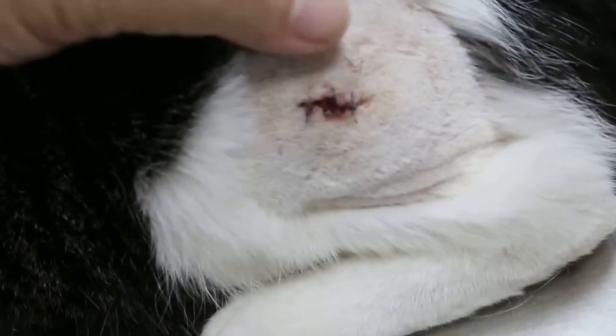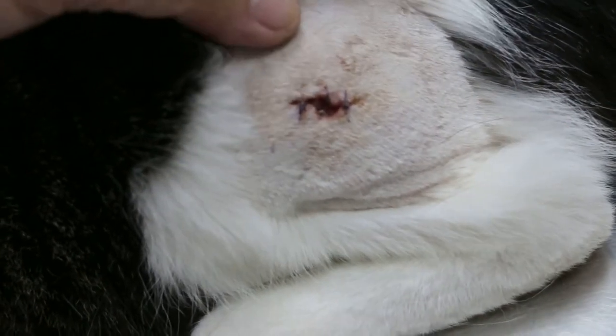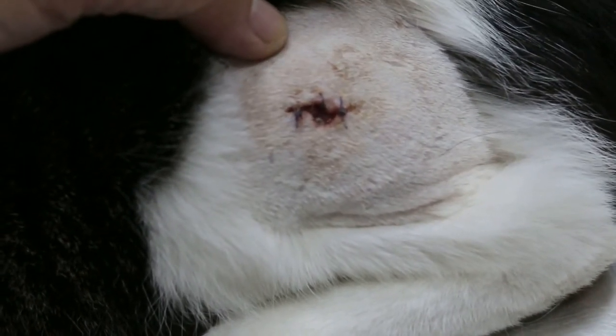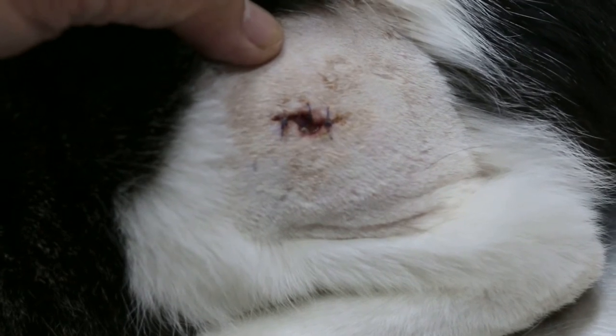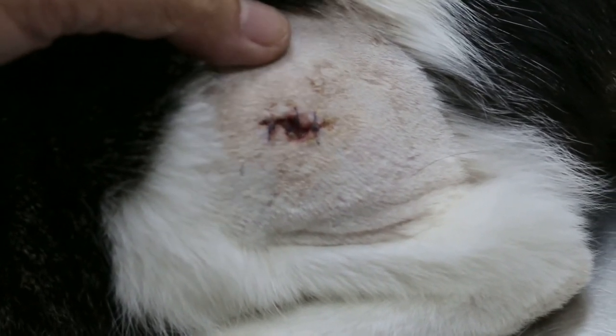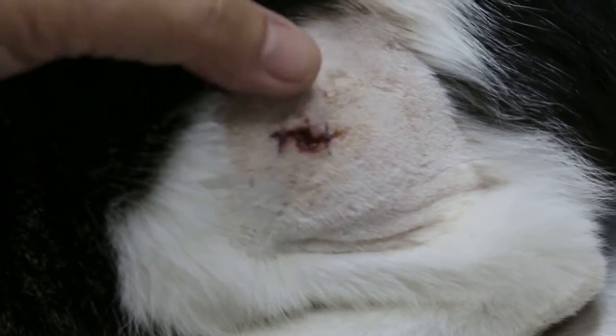So now what I suggest is I take out the stitch. No use already. Then give the painkillers. Painkillers and then the owner wash it about two weeks, three weeks, it will close up.